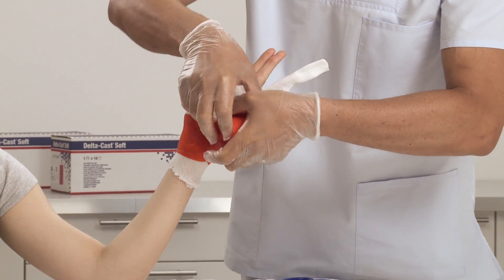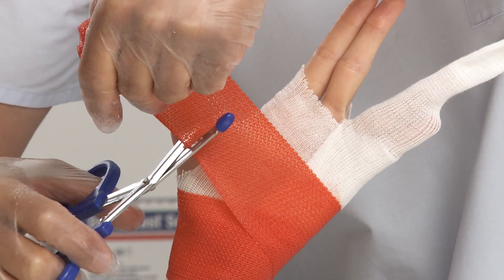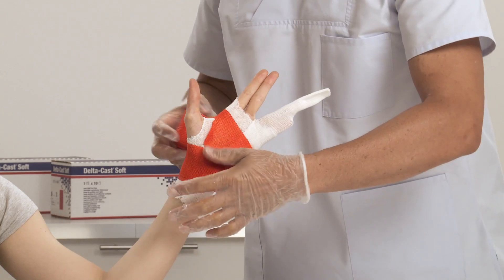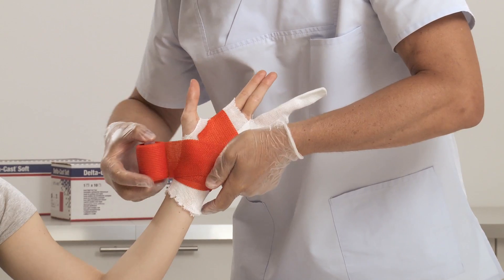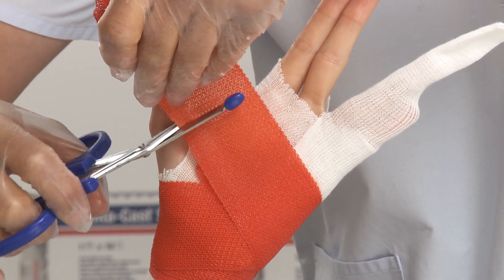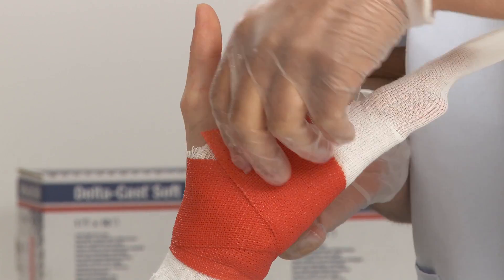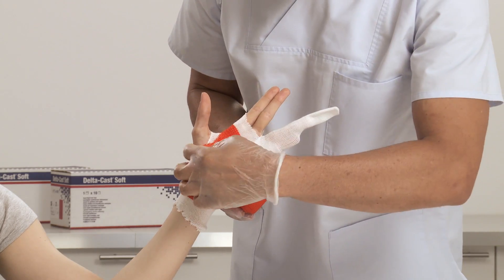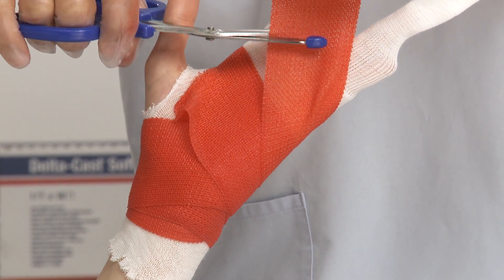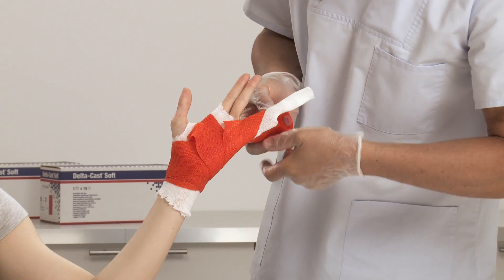Start applying the synthetic cast tape at the wrist. Make a cut at the thumb to easily pass once through the web space, and make sure to catch the ends below the thumb when going around the wrist. Move towards the proximal end of the ring and small finger, making a cut to pass through the web space between the middle and ring finger.